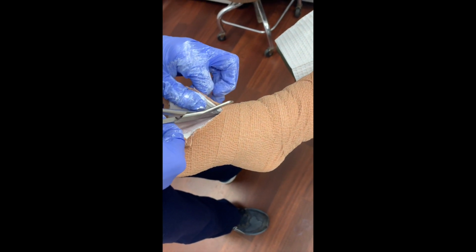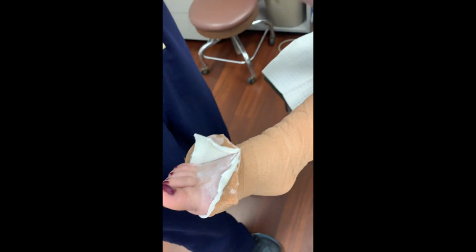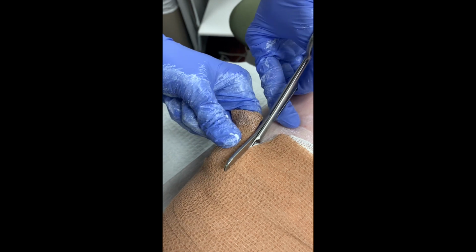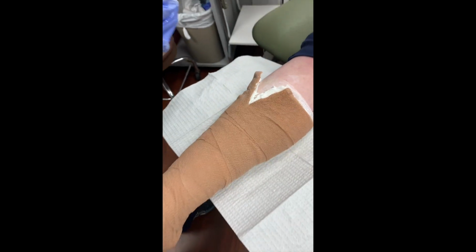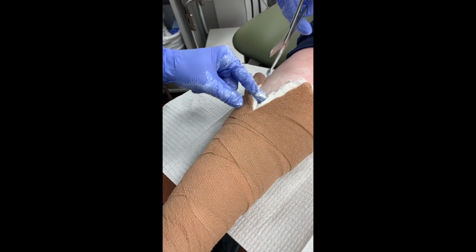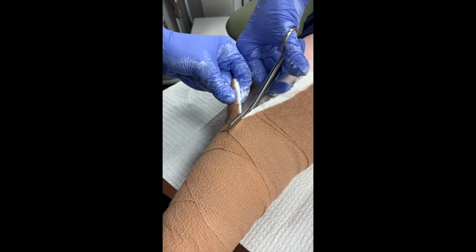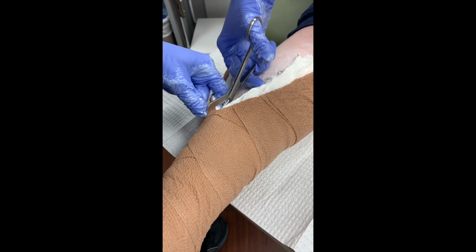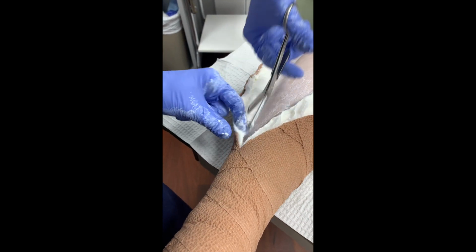No. Okay. Another thing to be mindful of is some of your patients are neuropathic. We just put this UNNA boot on, so you do see some of that paste still there. And you can come from the proximal end as well. Ride your finger underneath, guiding it, lifting it away from the skin, making sure your scissors are pointed upward. There's a blunt tip here that doesn't allow the skin to be punctured, but go slow and steady. Check in with your patients, making sure they're comfortable, because some patients will see scissors and automatically be a little bit more fearful. So put them at ease, put yourself at ease, making sure that you're not causing any new problems. Good.